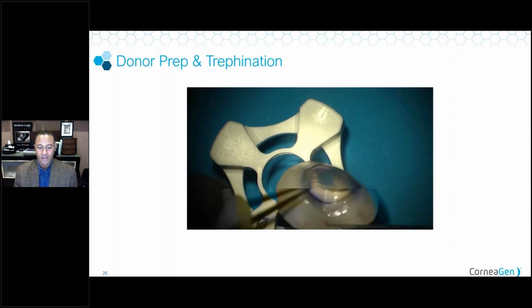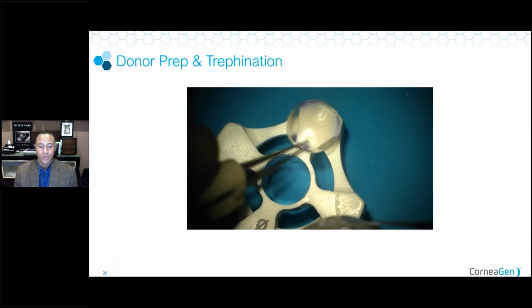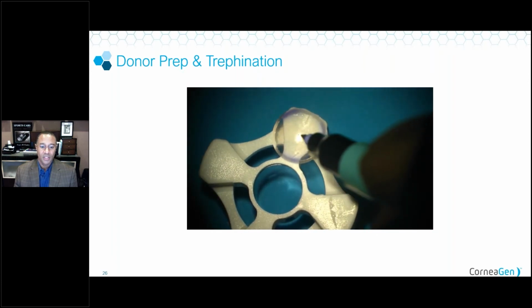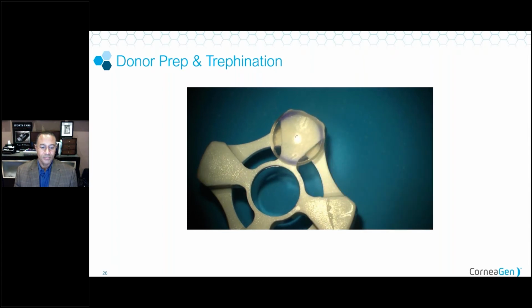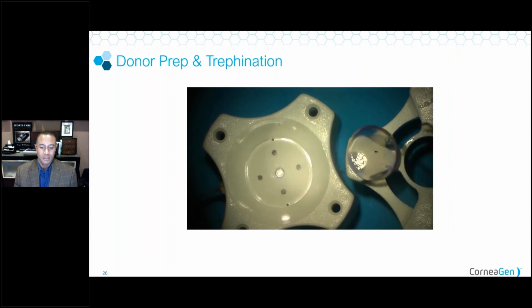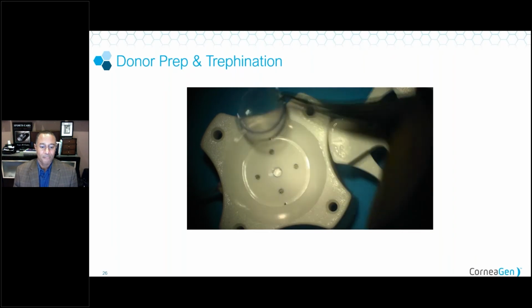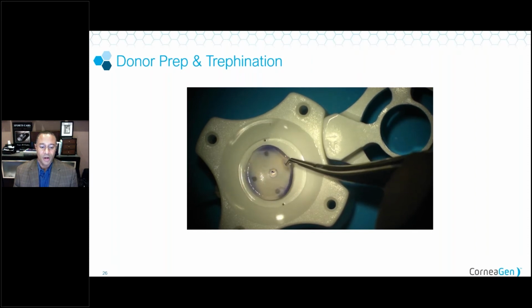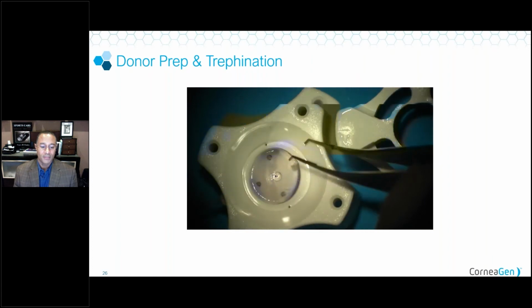Here we're taking off the donor from the carrier after we've rinsed it off, and you can see just how clear it is. Again, mark the center visually. Then we're going to take that graft and flip it over. We've got stroma there, remember no endothelium because this is a lamellar. And then we're going to place that center dot in the well over our recipient, our donor trephine spot.